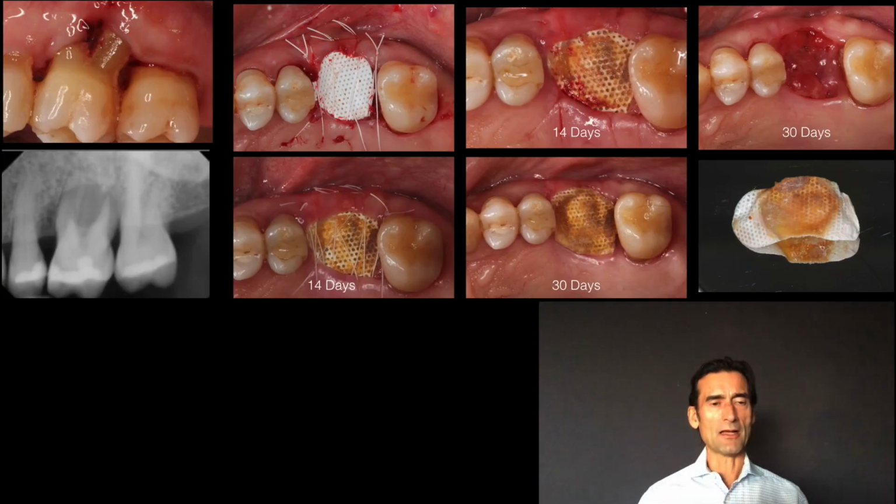So here's a patient. On the left photograph, you can see the tooth, the molar, which has to be removed. There's a furcation involvement. There's bone loss. It's the posterior. So I removed the tooth, then cleaned out the site, removed all the granulation tissue. Again, got nice bleeding. I placed the bone graft here. In this case, I used a mineralized allograft. The main reason was that there maybe were still some remnants of bacterial content there, although I cleaned and irrigated it well. So I wanted something which possibly could resorb if needed.